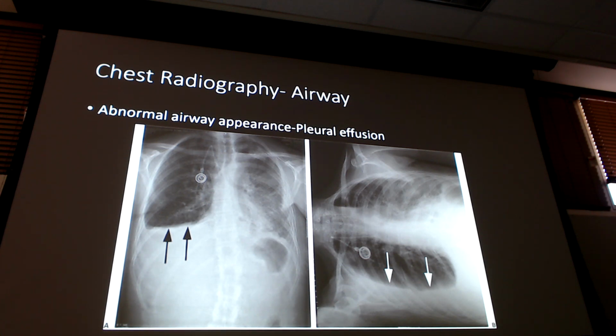So for anybody who's had a family member who's gone through chemo and things along those lines, or dialysis, it really wrecks the veins in the arms really bad. So what they'll do is they'll put this port in, it's direct access into the bloodstream to be able to give medications or things along those lines. You see this in a lot of cancer patients and a lot of dialysis patients. They'll have a port permanently placed for any type of medications that they may need.